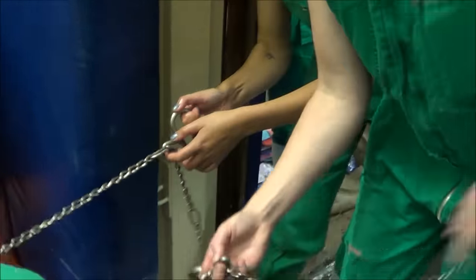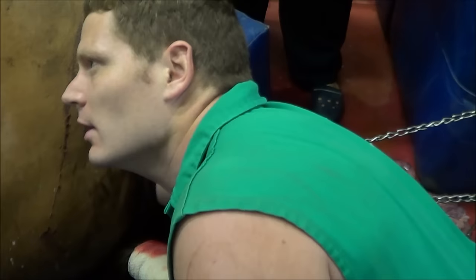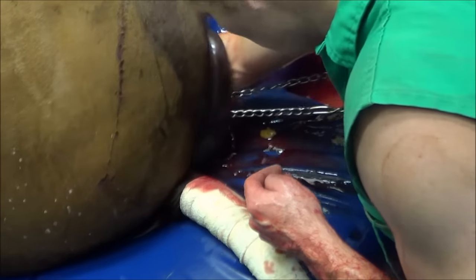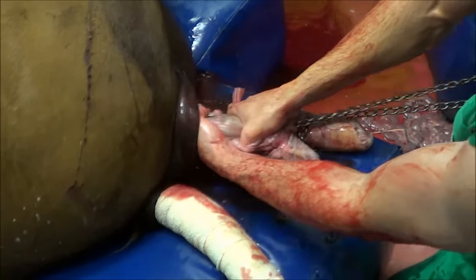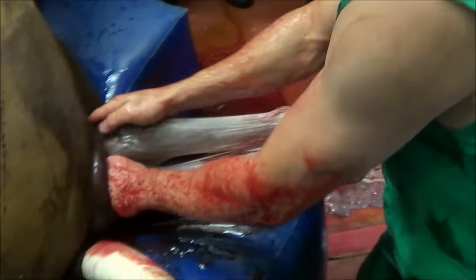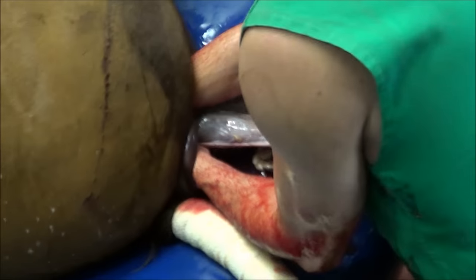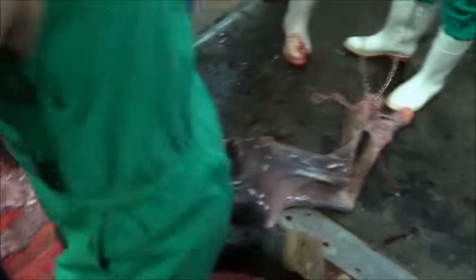Pull. Pull. Lock it down nicely. You guys pull. It's coming. Nice. Pull — oh, here we go. There's some meconium. Here you can stop. I can tell them it's out.